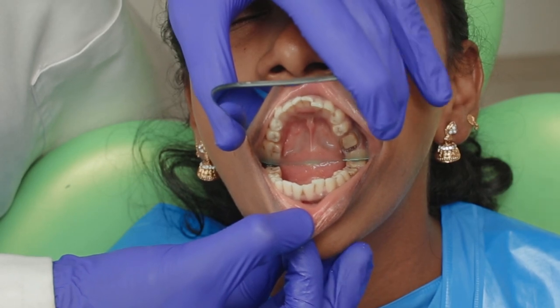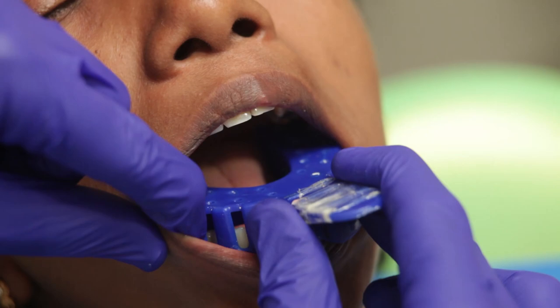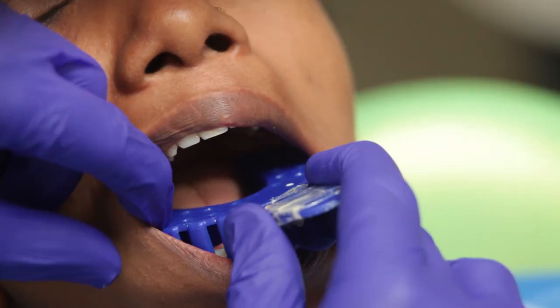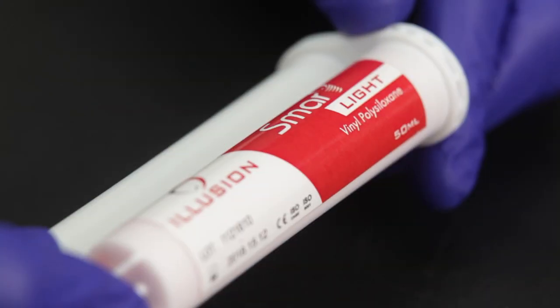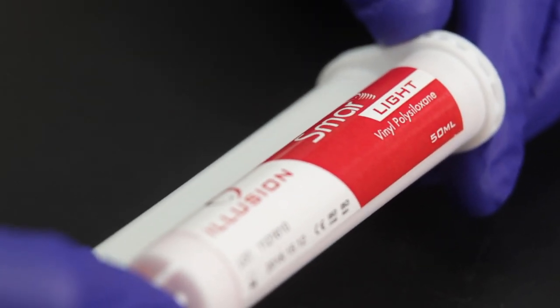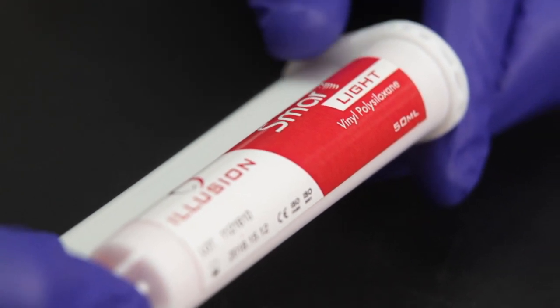I have a lower first molar prepared and it is ready to be recorded in the impression. Firstly I will take a one-step impression of this prepared tooth. The ideal material for a single-step impression is a heavy body with a light body. I don't normally recommend putty for this because the light body tends to get washed out because of the bulk of the putty.